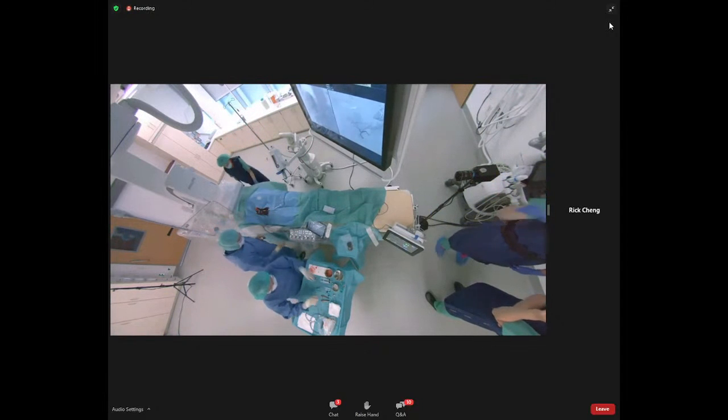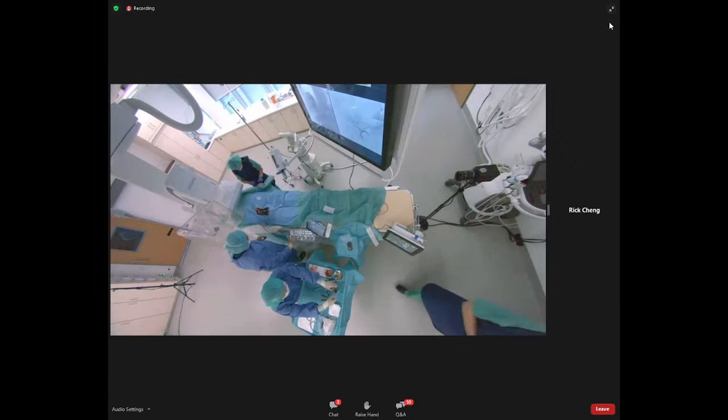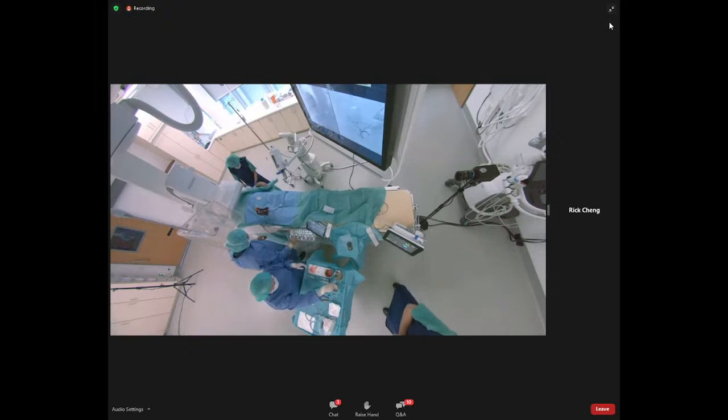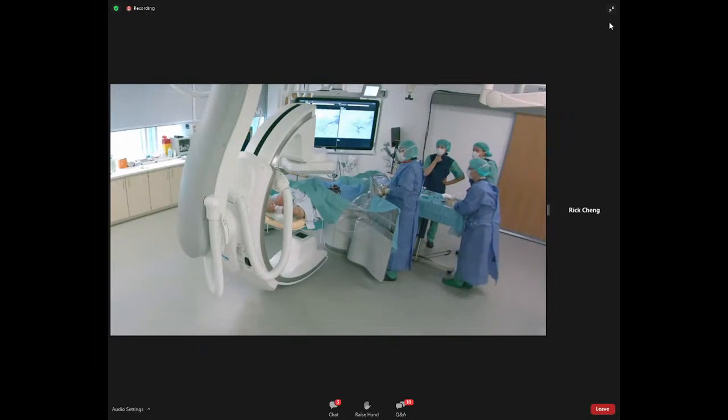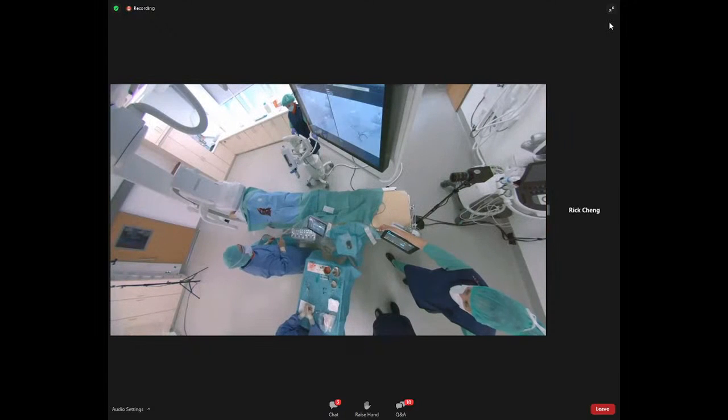scan. To have an optimal result, the patient's arm should be out of the X-ray beam to avoid streak artifacts in the cone beam CT volume. Hands under the head would be the best position if this is possible. Also take care that no wires and infusion lines are hanging from the table. Be sure that the lead shields are out of the C-arm pathway to prevent collision during setup.